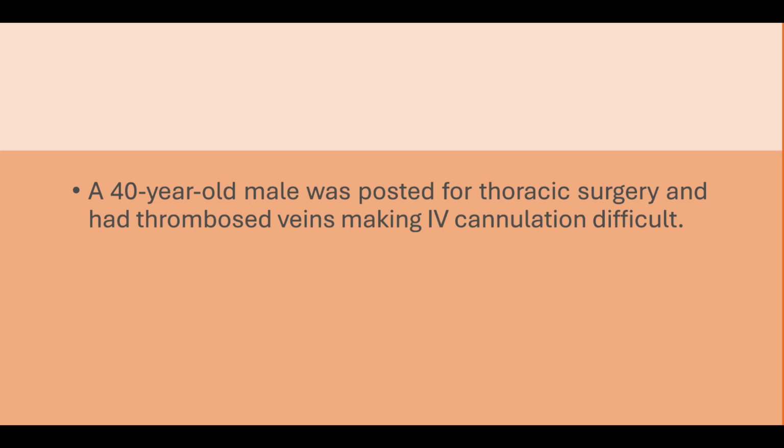Here is another case where we have inserted the USG-guided IV cannula. A 40-year-old male posted for the thoracic surgery and had thrombosed vein, making the IV cannulation very difficult.